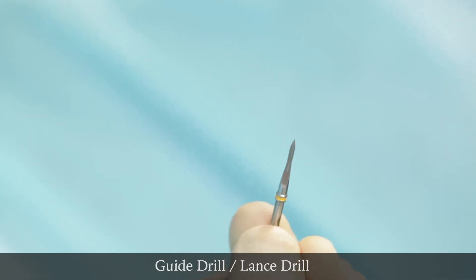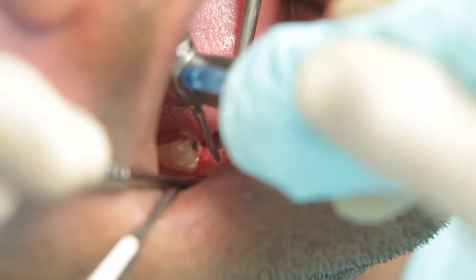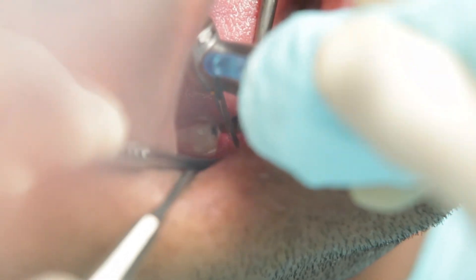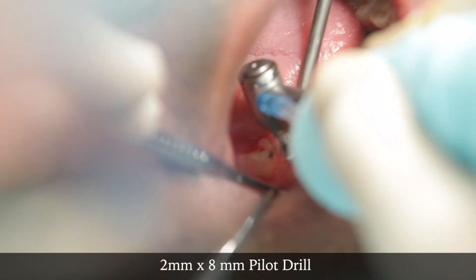Now the first step is to use the guide drill, or the lance drill as it is sometimes referred to, and just mark the site of the osteotomy. I will not go any deeper than a few millimeters here. The direction is fine, so I will go ahead with the 2 mm pilot drill.